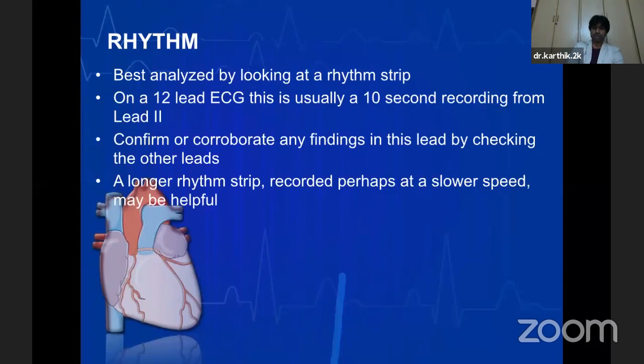So having quickly calculated the rate of the heart on an ECG paper, we go next to the rhythm of the heart. The rhythm is a very tricky situation, which is very important to know, because just by looking at the ECG, its rhythm and the rate, you can diagnose some of the lethal arrhythmias in a flash of a second. So the rhythm is first best analyzed by using the rhythm strip, which is the lead 2 on a 12 lead ECG. Usually it is taken and represented at the bottom for a 12 channel lead ECG. And you have to see the rhythm strip and corroborate the findings by looking at the other leads.